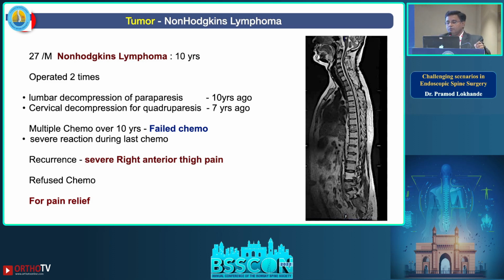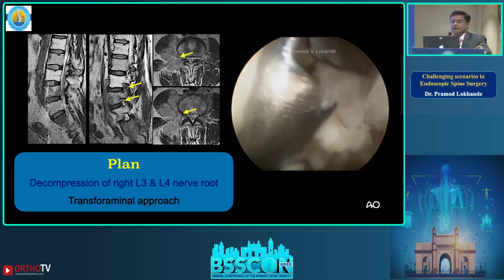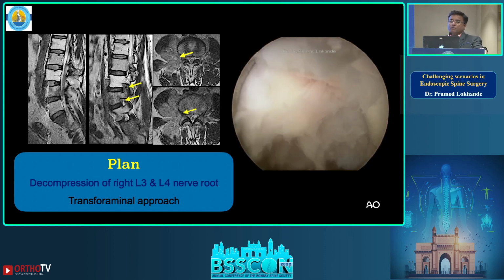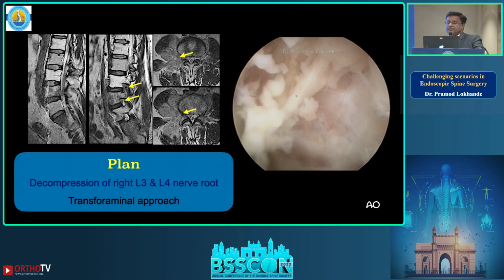So what could we do for pain relief? So these are the MRI pictures. You can see that there is occlusion of both the foramens with the tumor invading the foramen. And this is what I did.